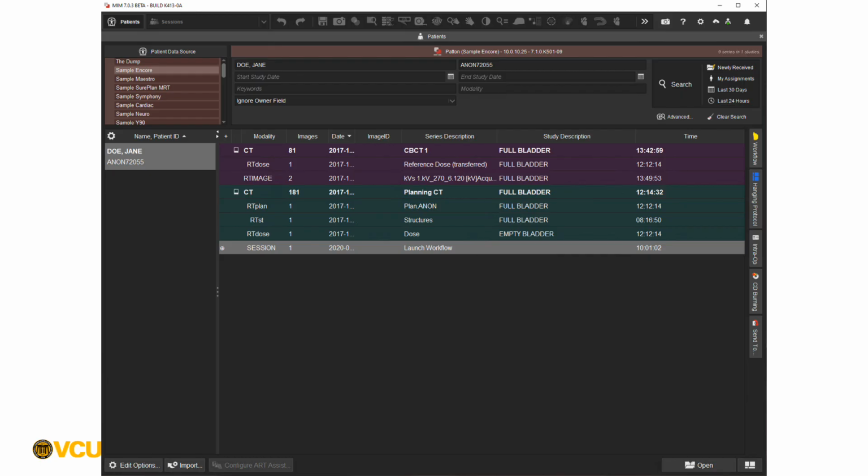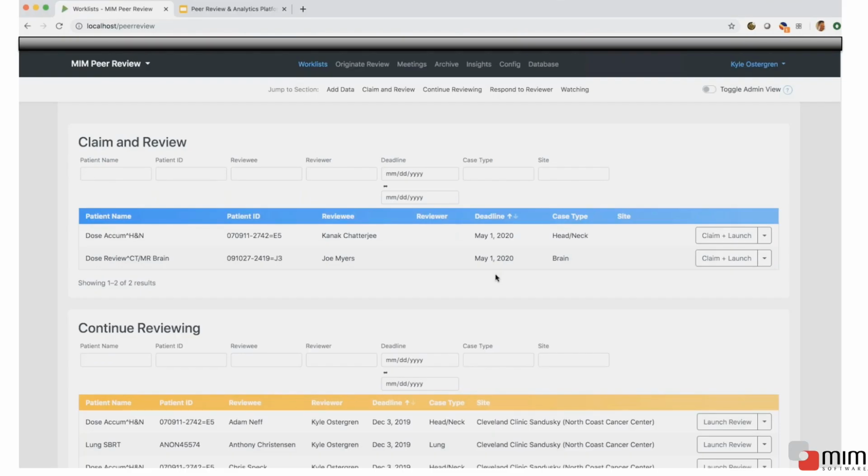So instead of having this classic patient list, we are working with them to adopt their peer review look so that the patient list that residents would see when they log onto the web-based platform that we're creating looks more like this. So it's more straightforward, more user-friendly, where they can just go to the patient that they want to work on and they can just pull it up.